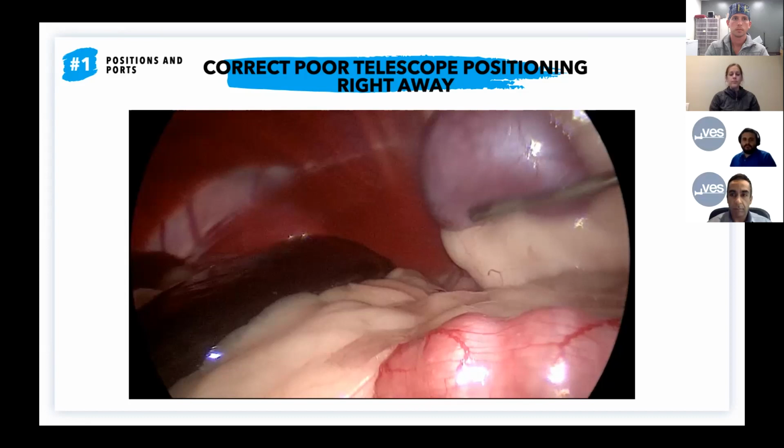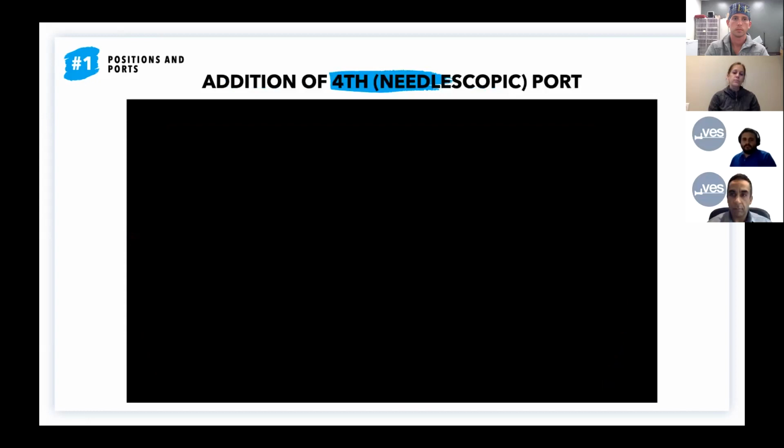One thing that I'm not shy about these days is that I think you have to be careful not to have that macho thing where you say, oh, I did it with so few ports and it was great. I'm actually a big fan of putting a fourth port in these guys now. I'm lucky, it's a bit of an ivory tower thing, but we have a needlescopic set now, which is a 2 millimeter set. Those ports are absolutely tiny.